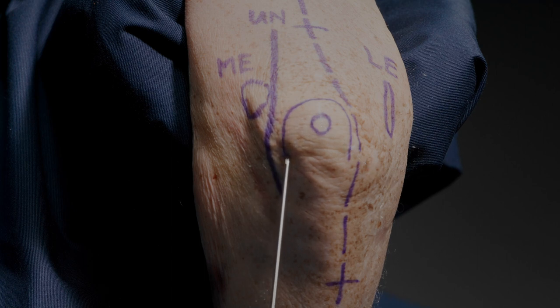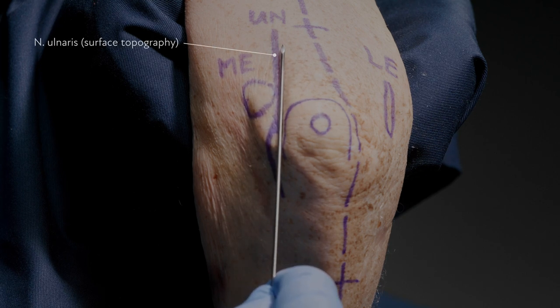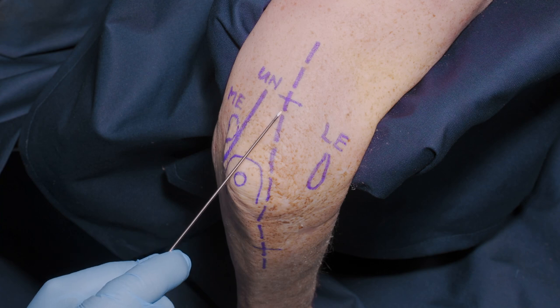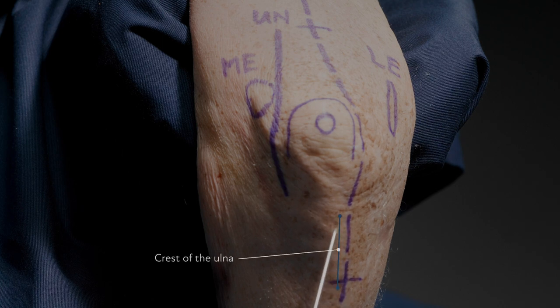The most important relationship we have to be aware of is the relationship between the olecranon and the medial epicondyle, with the ulnar nerve lying in its sulcus between the two. The incision we're going to demonstrate is the standard posterior or dorsal curvilinear incision going radial to the olecranon.